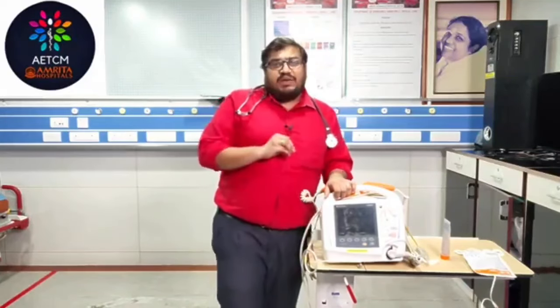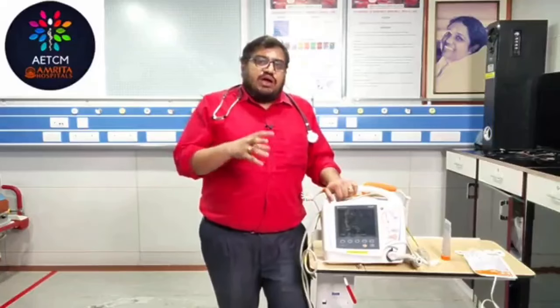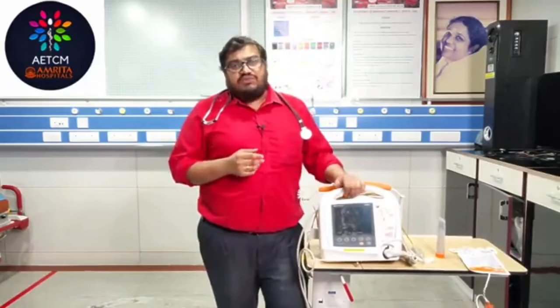Now, defibrillators are basically used for two purposes: defibrillation and cardioversion. As the word implies, defibrillation means you defibrillate the heart by providing external energy. In cardioversion, you are converting the rhythm of the heart by providing external energy. So that is the difference between defibrillation and cardioversion. Let's see the key features of defibrillation.